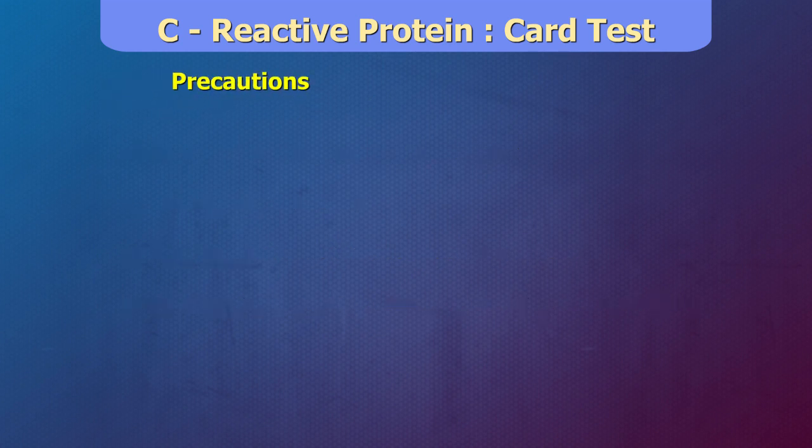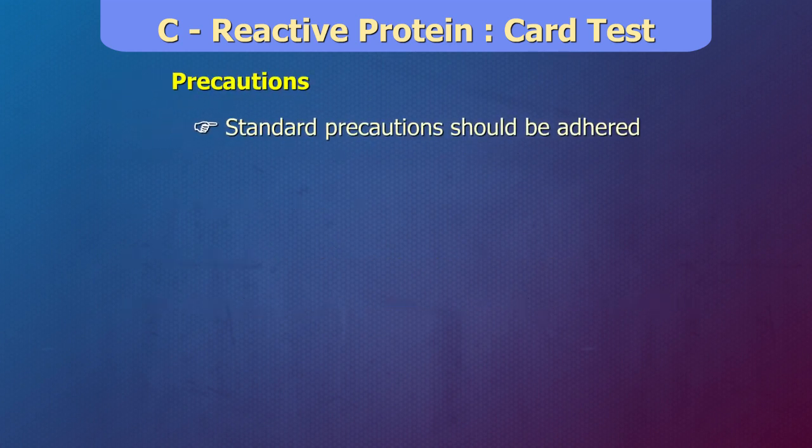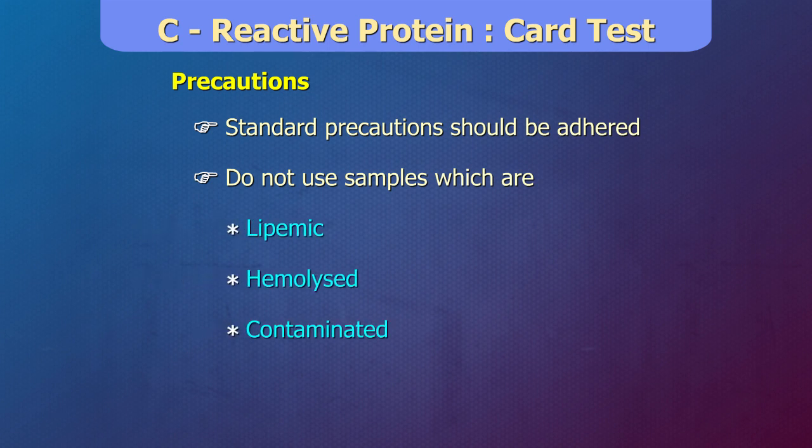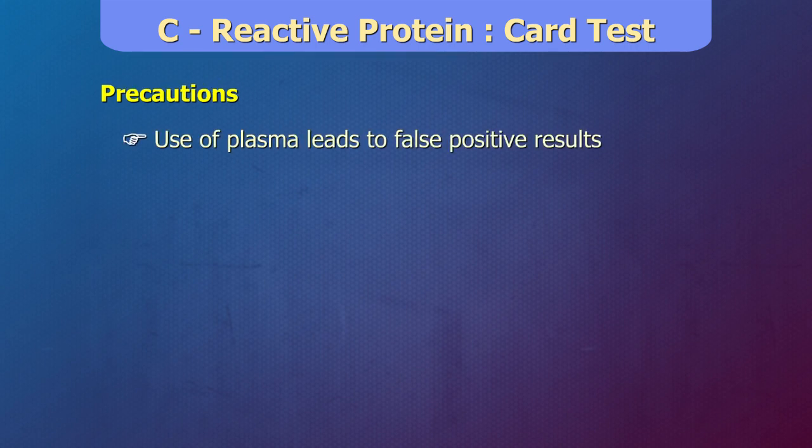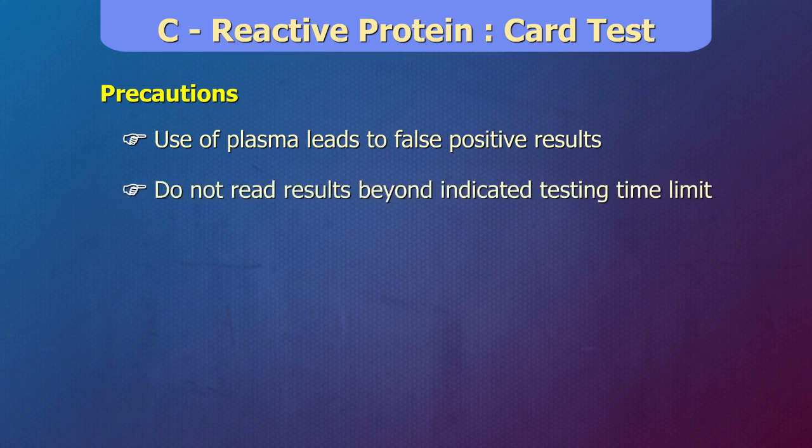Precautions. All standard precautions should be adhered to while handling the test samples and performing the test. Do not use markedly lipemic, hemolyzed, and contaminated serum samples. Use of plasma rather than serum can lead to false positive results. Do not read results beyond indicated testing time limits.